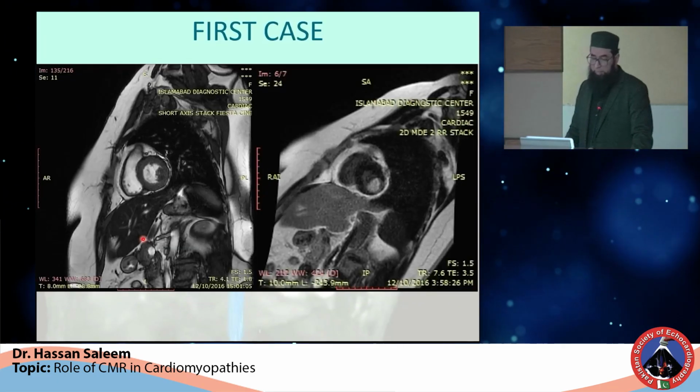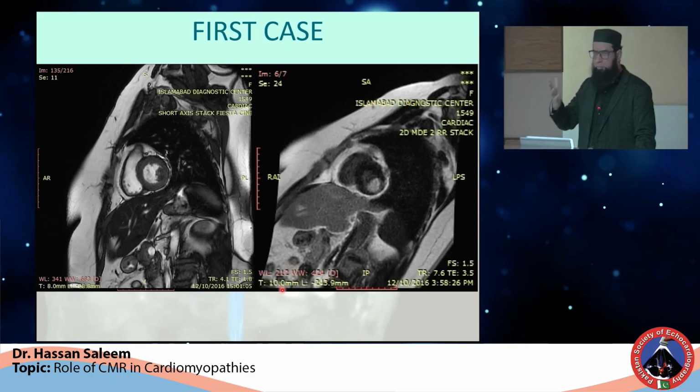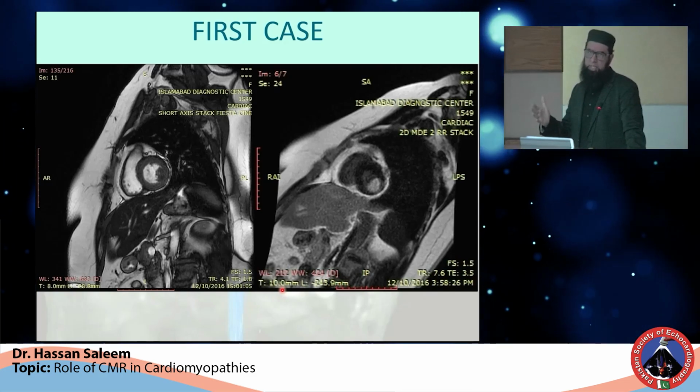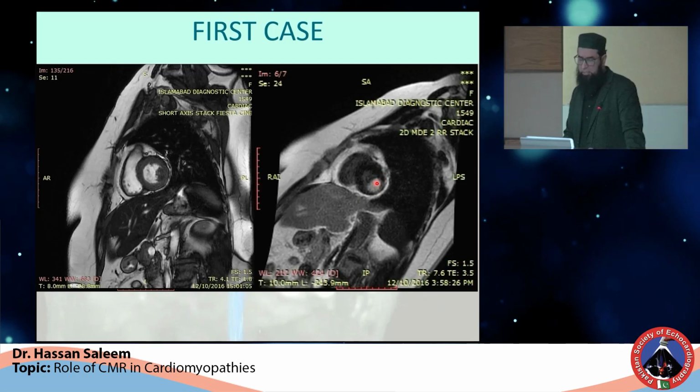We do get a lot of patients with masses. This is my first patient in 2016. I think middle aged, her age was in the 50s, and she had a mass on echocardiogram. There was an enhancing mass in the inferolateral wall.